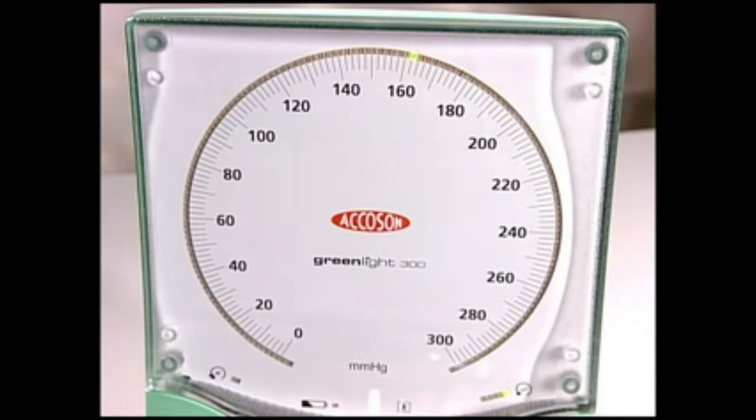The GreenLight 300 displays the deflation rate on indicators to the lower right and left of the pressure display. If the deflation rate is 3 millimeters of mercury per second or under, one of the five green indicators at the bottom right of the dial will come on. The middle of the five green indicators represents a rate of about 2 millimeters of mercury per second.